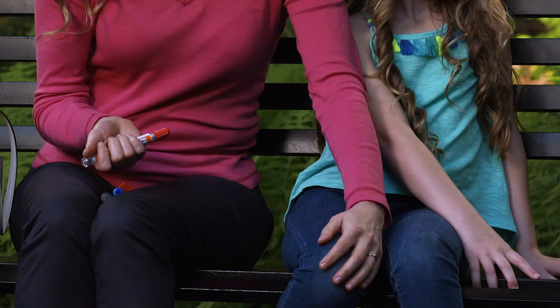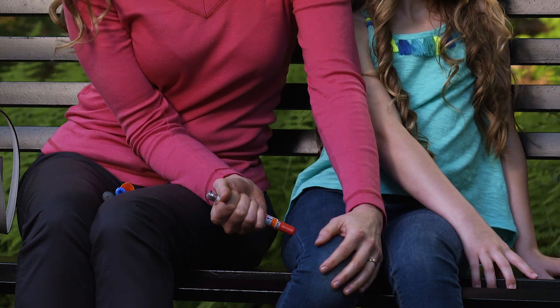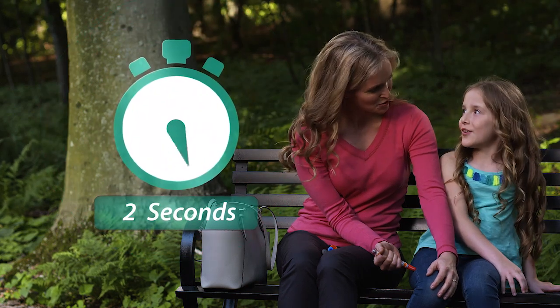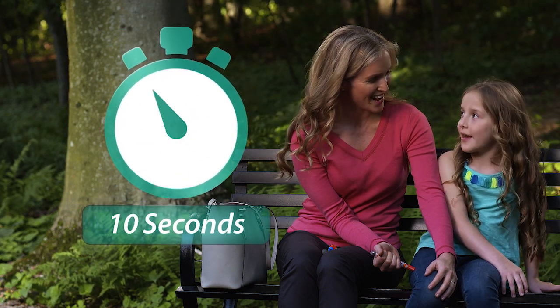Hold the child's legs steady and firmly to limit movement. Position the auto-injector at a 90-degree angle on the outer thigh, then press down hard and hold firmly for 10 seconds: 1, 2, 3, 4, 5, 6, 7, 8, 9, 10.